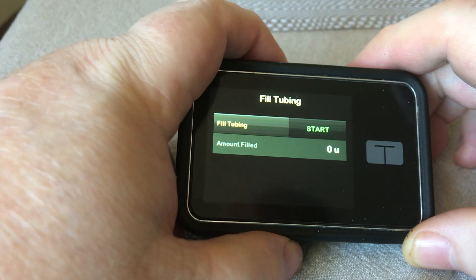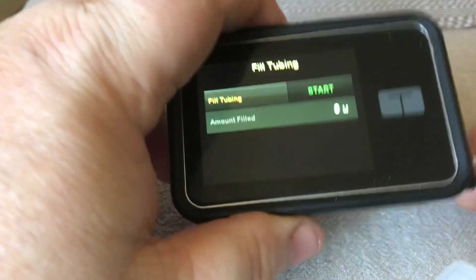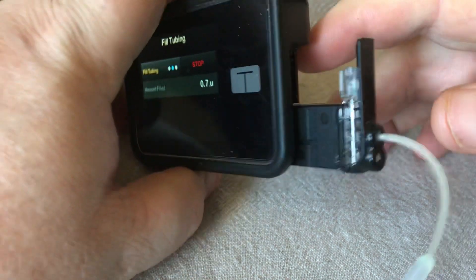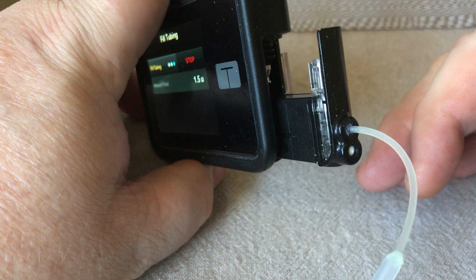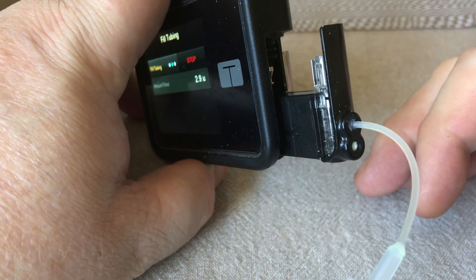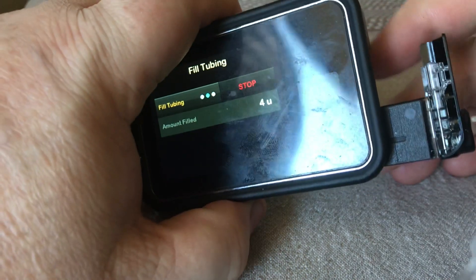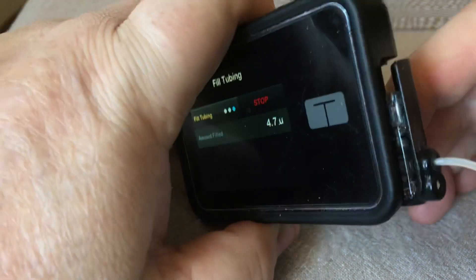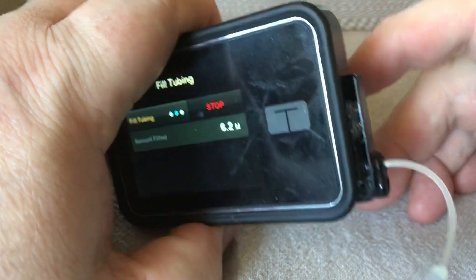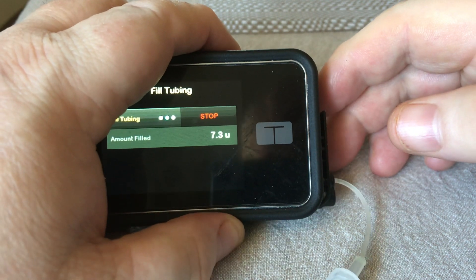Now, before I press start, what I do is I turn it over and just dislodge the cartridge. Now I press start. Because it's not actually in place, it's not going to send any insulin down the tubing. There you can see the piston operating, going back and forth. Because it's not engaging with the cartridge, obviously nothing is going to be sent down. Now, as this gets to 10, I just have it sitting here — the piston's still not engaging. Plenty of gap. Approaching 10.